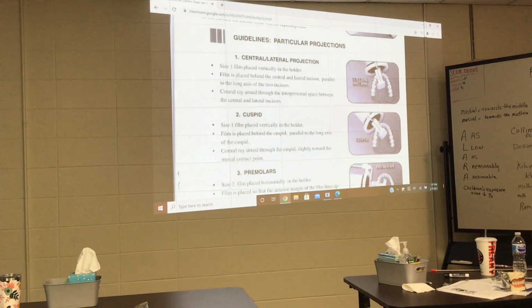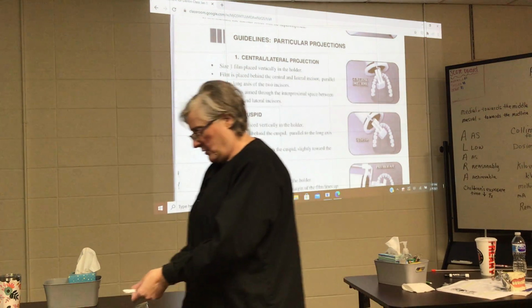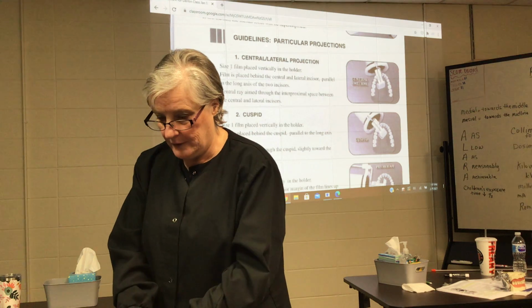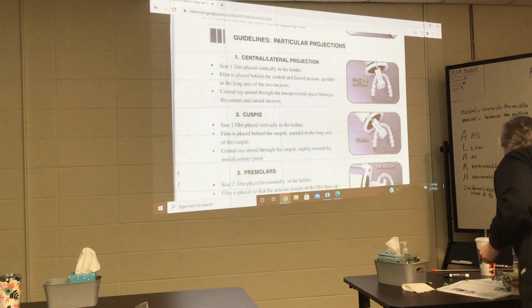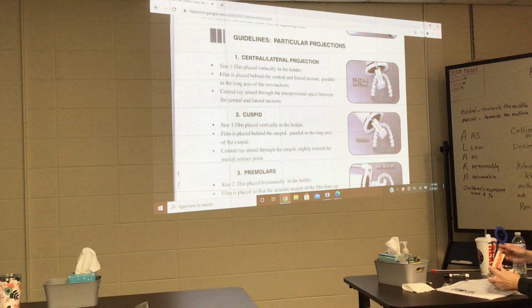This is a size 1, and this is a size 2. You can see the difference. This is narrower and more comfortable for the smaller area of the anterior. See, it's smaller. Okay, so we're gonna start with a size 1, dot in the slot, white towards the light. And it fits in just like that.